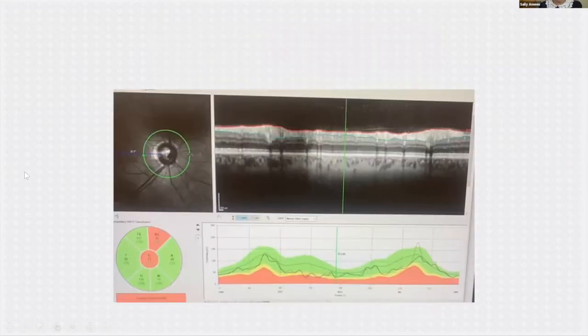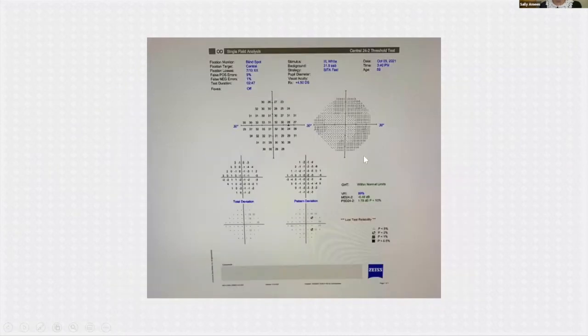Now, this patient is also someone that I met today. And again, if you look at the optic disc, the main issue is superiorly. So you would assume if they were going to have any kind of visual field defect, it would be inferiorly. Actually, their visual field, again, not the most accurate. They did have quite a bit of fixation losses, 7 out of 10, with false positives and false negatives. And it does tell you the test is not very reliable.